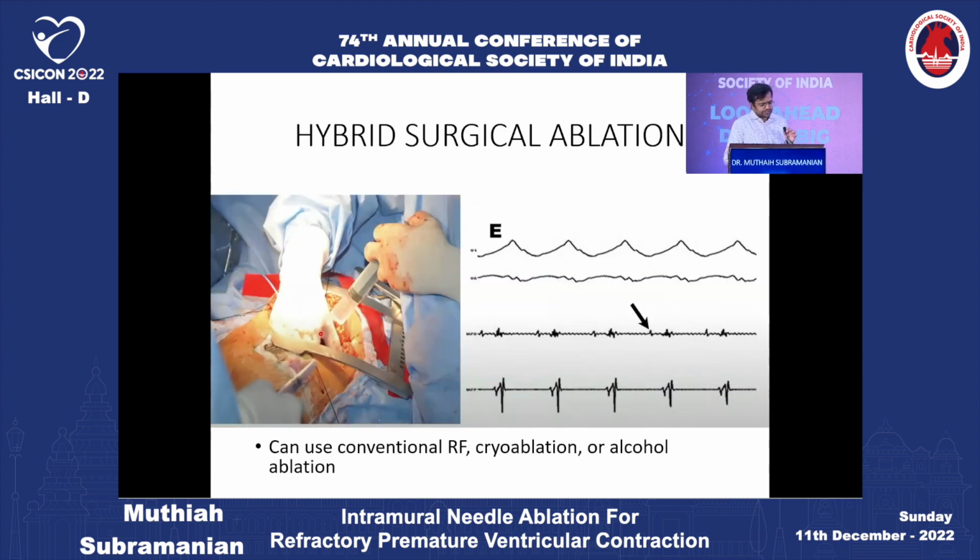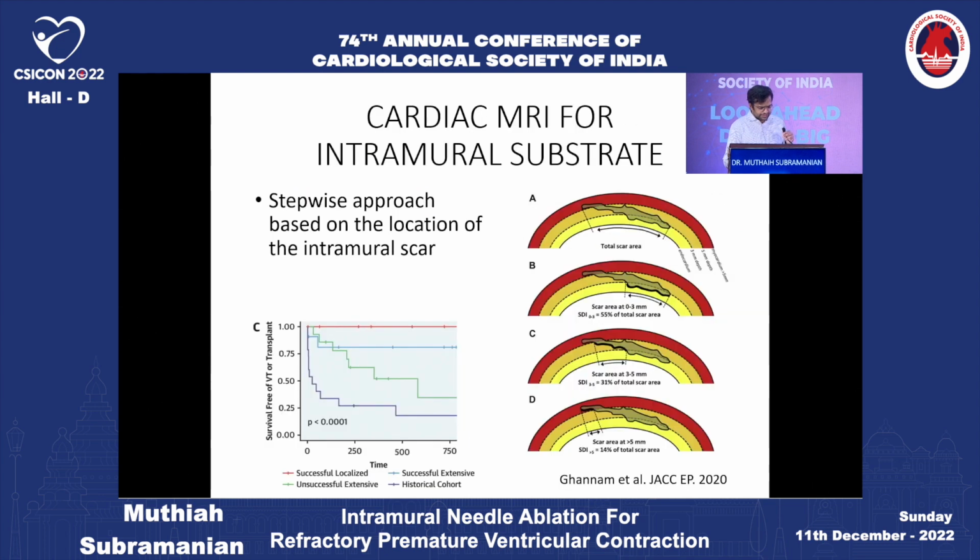This was our case where a posterolateral thoracotomy was done, and you can see one ablation catheter coming in from the side. We had the surgeon tie the ablation catheter to his finger, and he used it to map through the thoracotomy incision. This is helpful in patients where epicardial access is not possible, maybe because they're post bypass or post previous cardiac surgery. Once this is done, you can do traditional RF, now you can use cryo, or you can even use intramyocardial alcohol at these sites.